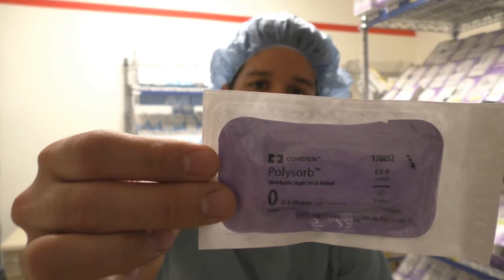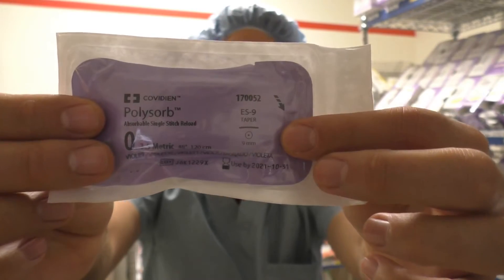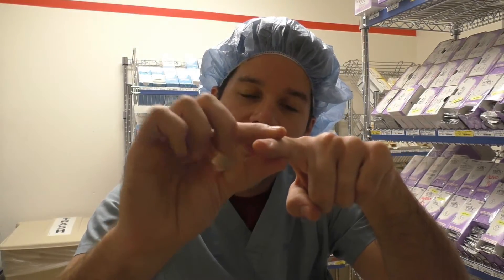Next one is this — it says Polysorb on it because it's an absorbable suture. But what's interesting is if you look at the needle right here, that's the actual size of the needle — it's just a straight little needle. This is actually used in a device called the Endostitch, which is used in laparoscopic cases. It's a long device, and at the end the tips come apart. You can load the suture into one side of the tip, and the surgeon passes the needle through the tissue and transfers the needle over to the bottom.